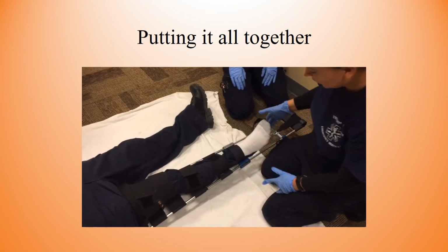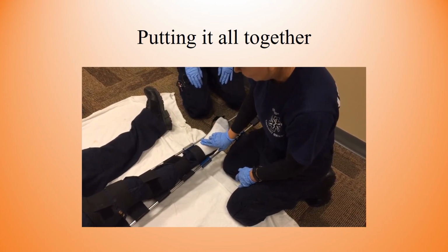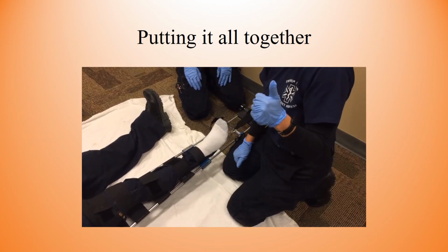Can you wiggle your toes for me? Can you feel me touching your toes? Yes. And there it is.